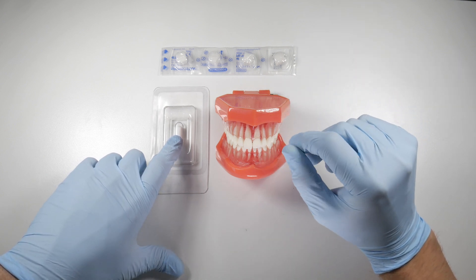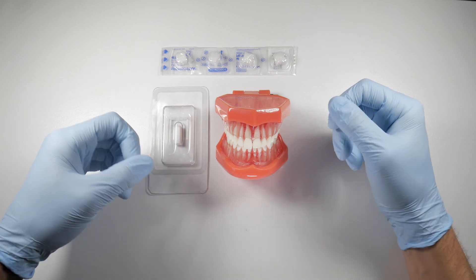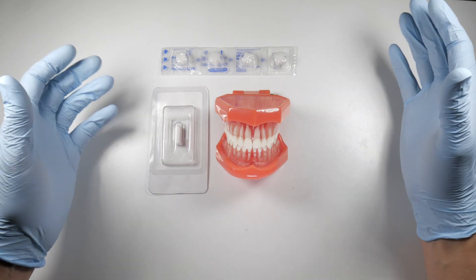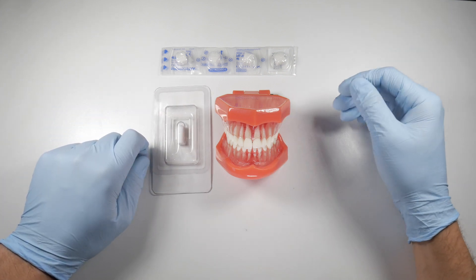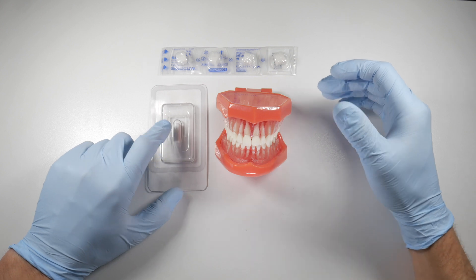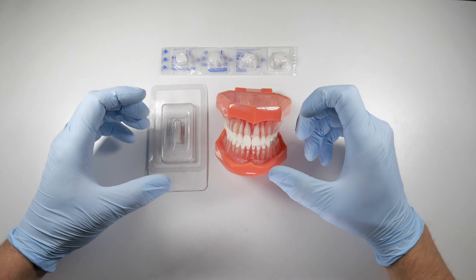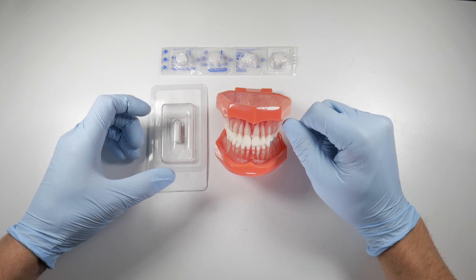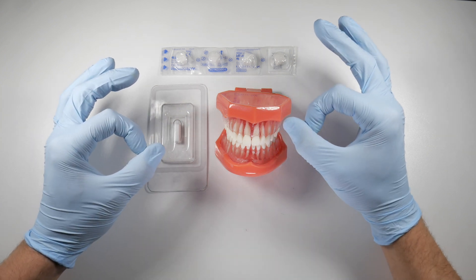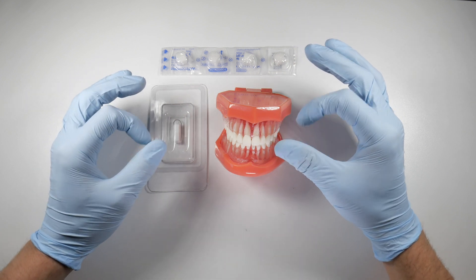If you put a gel foam sponge in there and don't pack it immediately, it basically starts to liquefy — you're trying to pack it and it's splitting apart and breaking down before you can even get it in there. I prefer coloplugs, which hold their integrity; you can pack them in and they stay together long enough to get good pressure into the socket, acting as a tamponade to block the bleeding. It really works very well.